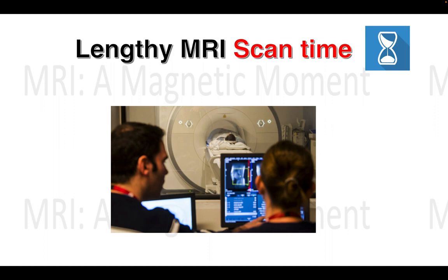Compared to X-ray and CAT scan, where the exams can be finished in minutes, MR imaging takes a lot longer. Once you start your clinical, and most of you are probably scheduled to go to clinical sites, you'll soon find out that most of the MRI sequences are lengthy.